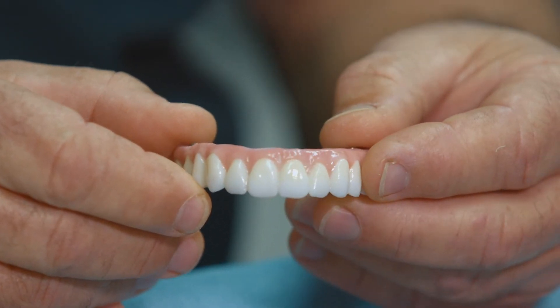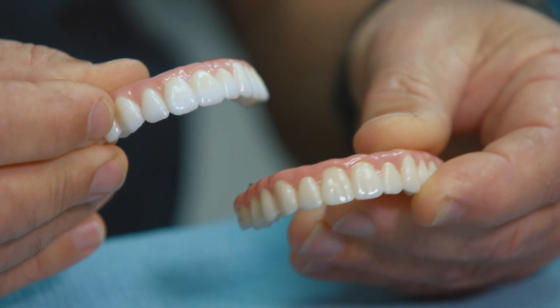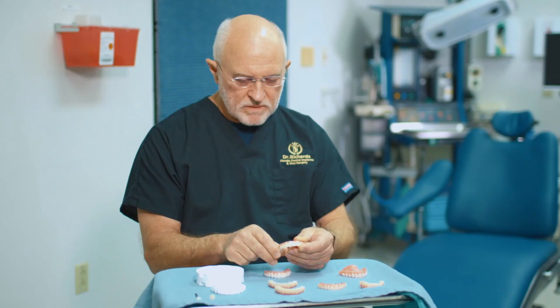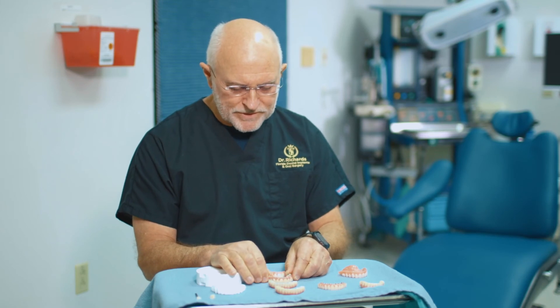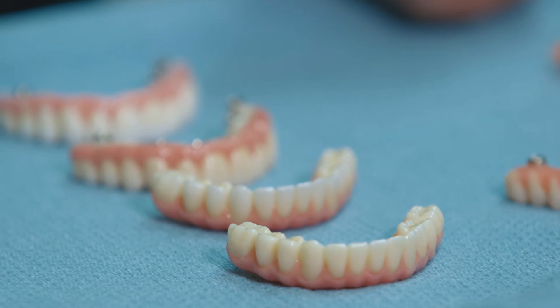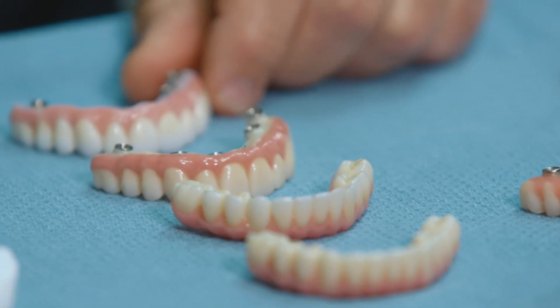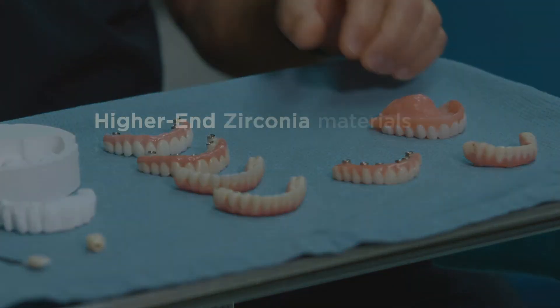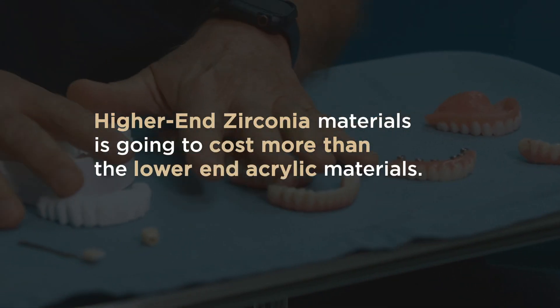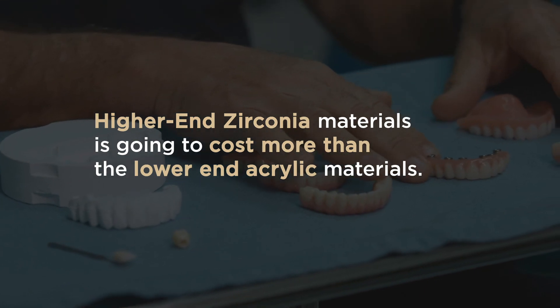You can also see the difference in the gum color. This is all custom work — these types of prosthetics are not ordered in size three, two, and one, so to speak. It's all custom, based on the individual's implants: how many they have and where they're placed. Because of that, the higher-end zirconia is going to cost more than the lower-end acrylic materials.